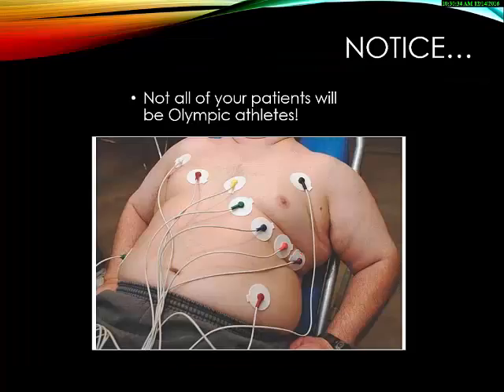I don't know. Remember that all your patients are not going to be Olympic athletes, so you may have to work around patients who are obese and large. Women who have very large breasts, you'll be having a difficult time finding the anatomical locations there. But remember, we're putting these skeletally. We're not putting them in relation to the skin. So somebody who is obese or somebody who does have very large breasts, you're going to have to move that tissue out of the way to make sure that you are putting the electrodes in the places that they're supposed to be.